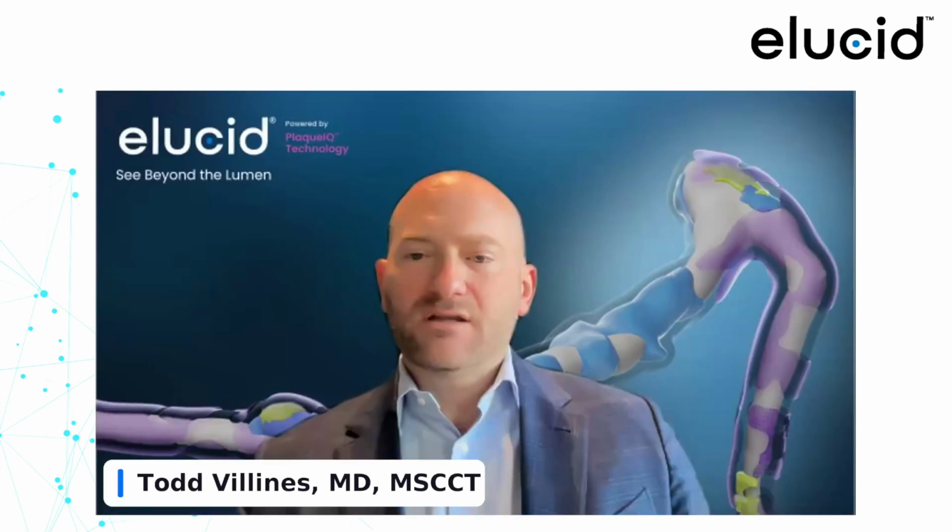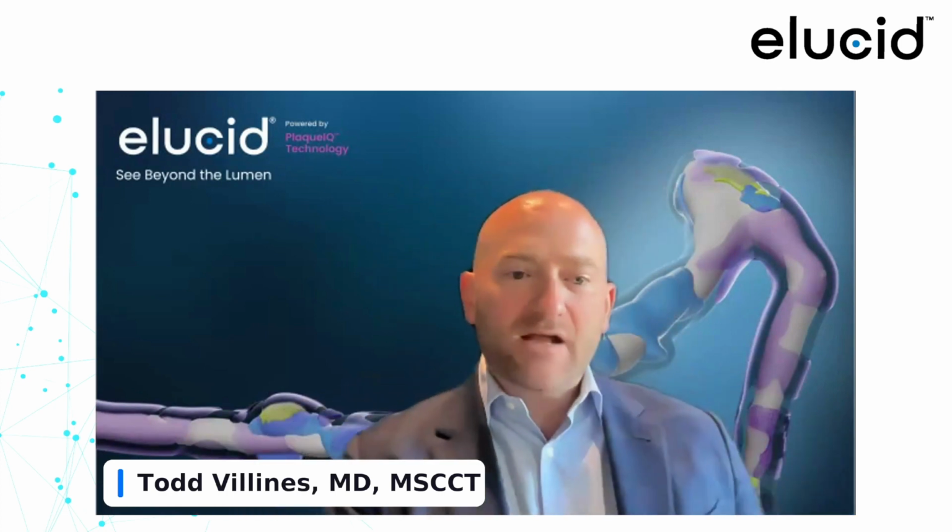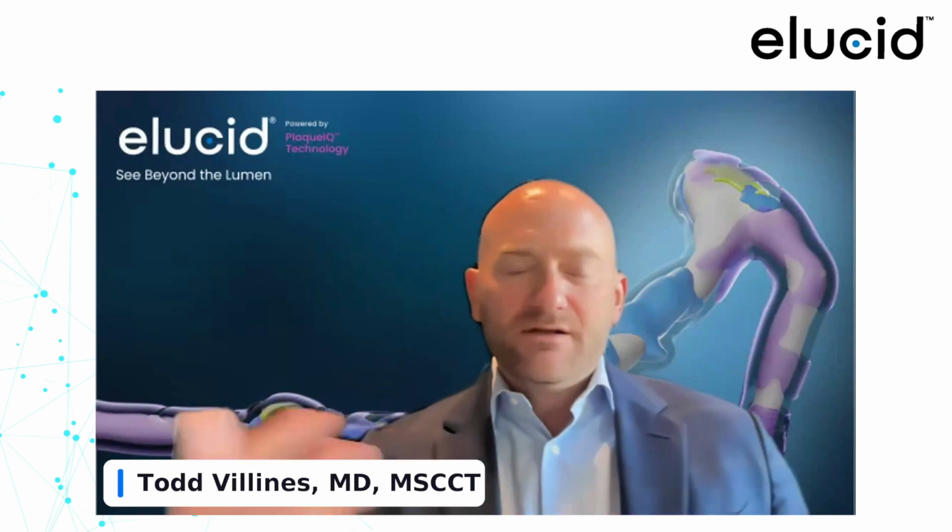Terrific. Well, I think for the sake of time, maybe we'll move on. I think there are some sites, like at MGH, that actually, even for throughput purposes, throw a nitro patch on when people walk in the door, and they've really timed their peak effect and timing based on that. So it's important to really think about your efficiency of operations. You mentioned, Eric, I think, if you're not able to get people oral, that's sometimes a little bit of a challenge and a wait time. So I think just being cognizant of that.